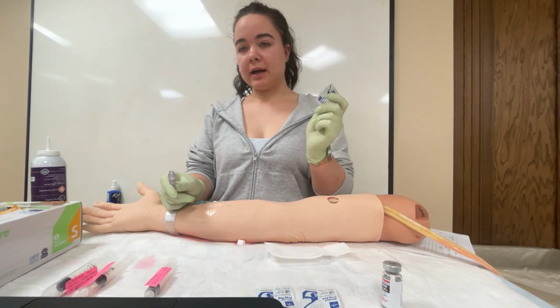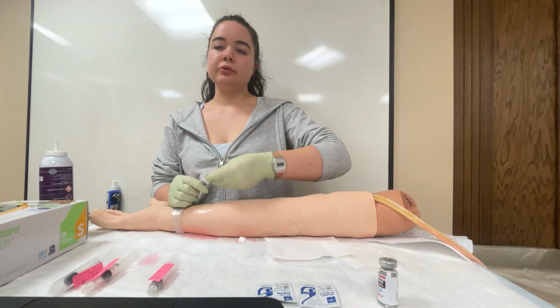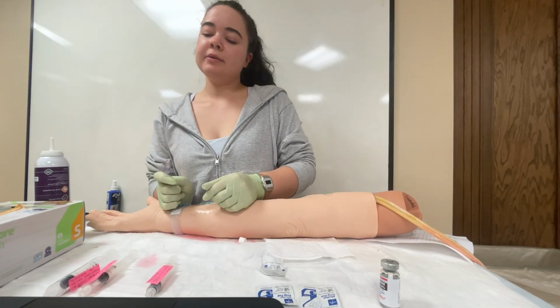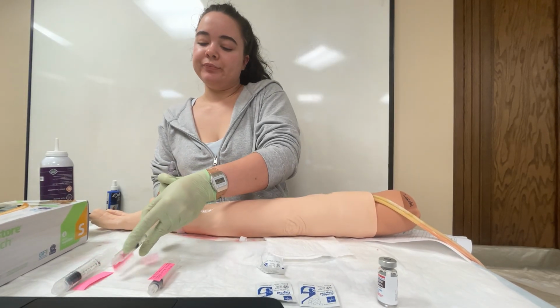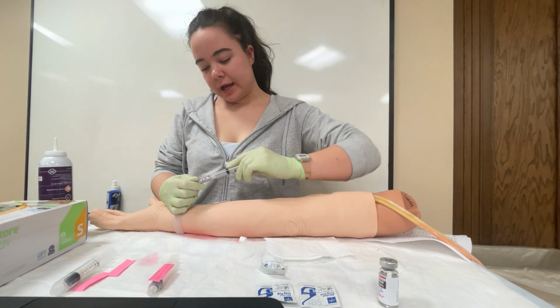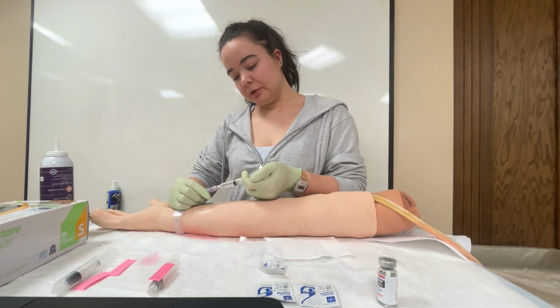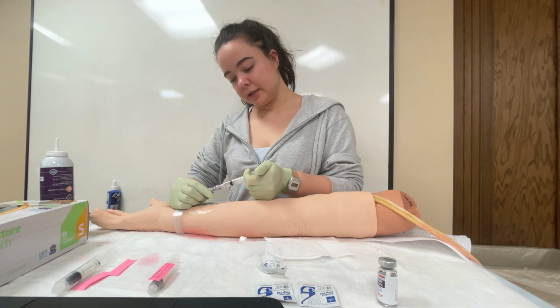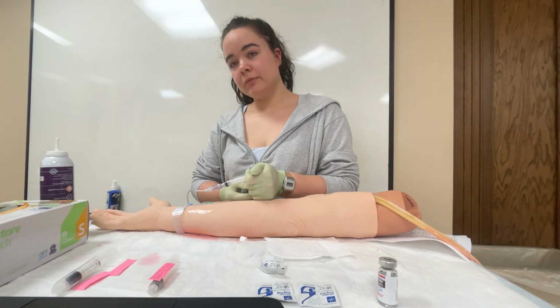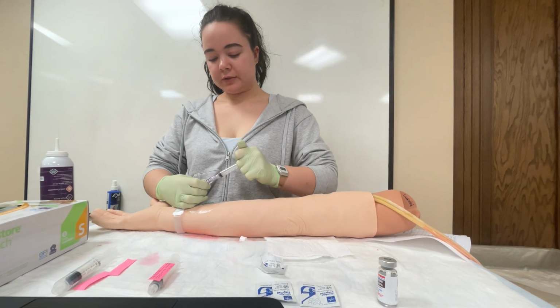I would take this out of its packaging in a real situation, and we're going to clean for 10. 1, 2, 3, 4, 5, 6, 7, 8, 9, 10. I'm going to allow that to dry. I have my pre-filled normal saline over here. I'm going to go ahead and connect this. I'm going to aspirate. I did get some blood return, so I'm going to go ahead and slowly inject my 3 milliliters of normal saline. Again, I am assessing for infiltration and inflammation. None were noted. Take this off.